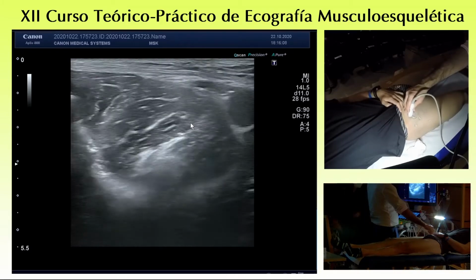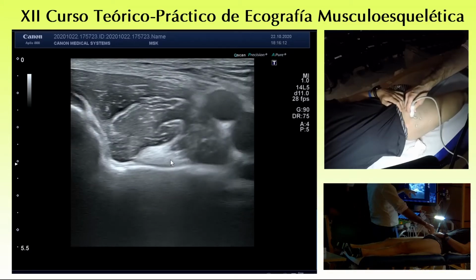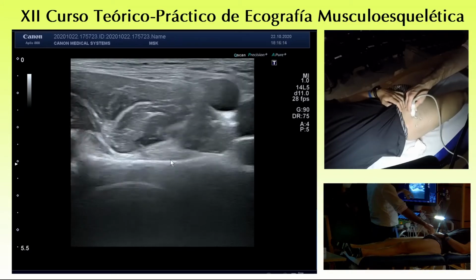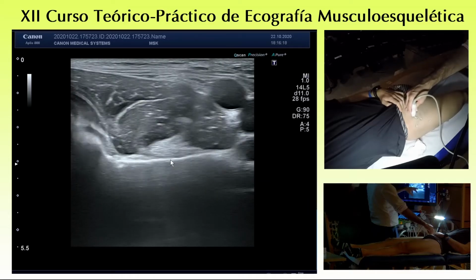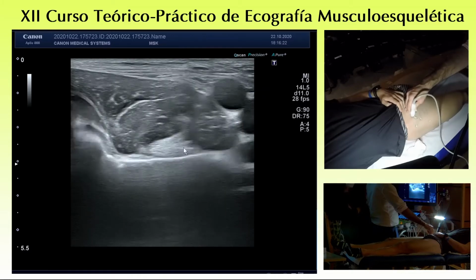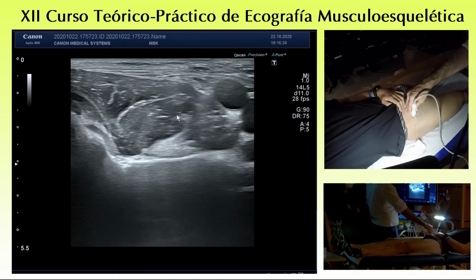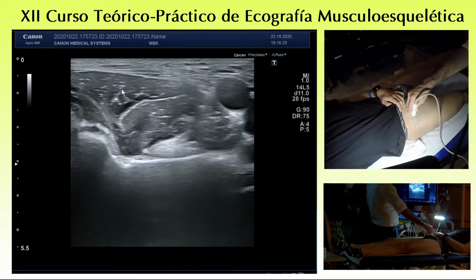It is the best place where you can see the typical anatomy of the iliopsoas complex, where you have the psoas, part of the psoas muscle, the medial psoas tendon with part of the muscle, the medial component of the iliacus and the lateral component of the iliacus.